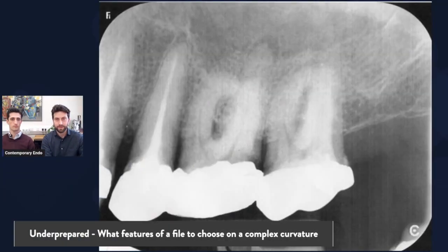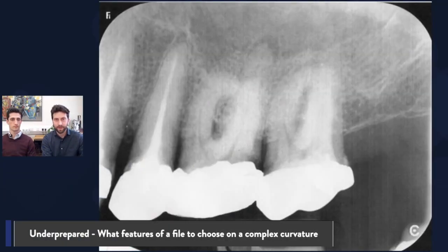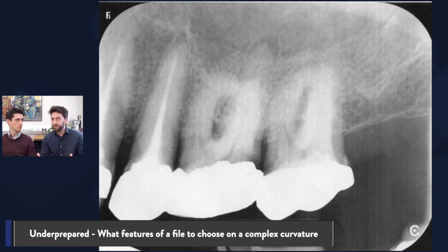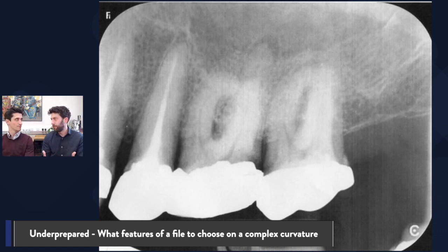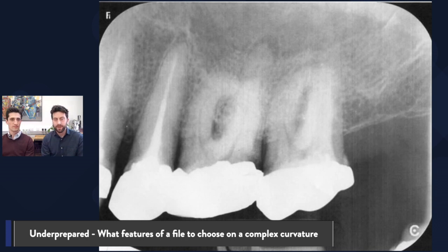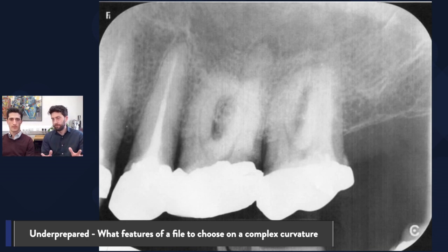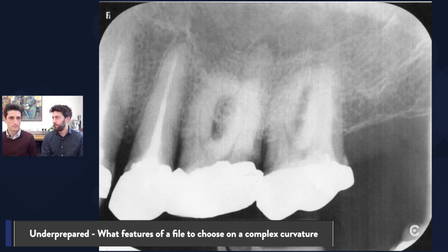So this is an upper left six that came across into my clinic. And what we're going to look at today is why this is a complicated curvature, and what features of the file are we going to choose to deal with a complicated case. I'll kick this right to you. We can see the caries there, the restoration — we're going to strip all that out. But why is this a complicated curvature?